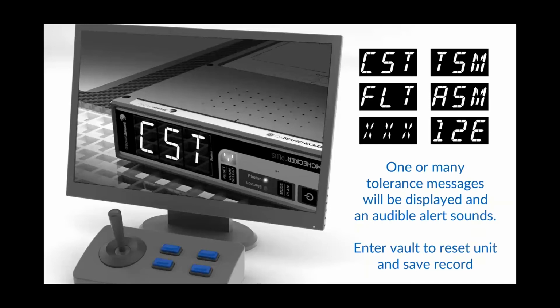So for any of these tolerances, if it's multiple tolerances, if you have both transverse and axial symmetry errors, it'll cycle through those error screens. So you'll see both, or whatever the errors were. And it also has an audible alert if there was an error. And you probably have to enter back into the room anyway, because if there is an error, you have to manually reset the unit as a stopgap cautionary step to make sure that you realize that there was an error on that particular delivery.